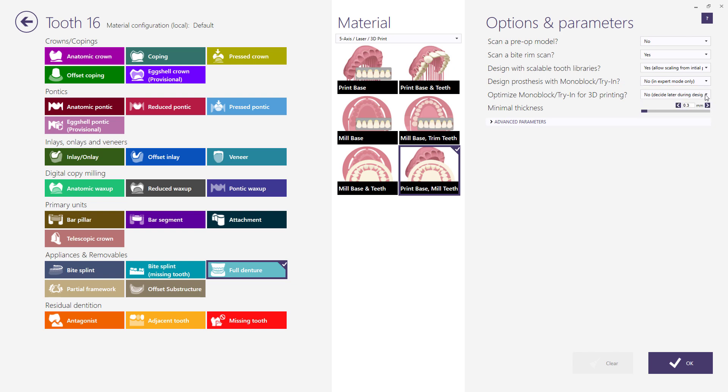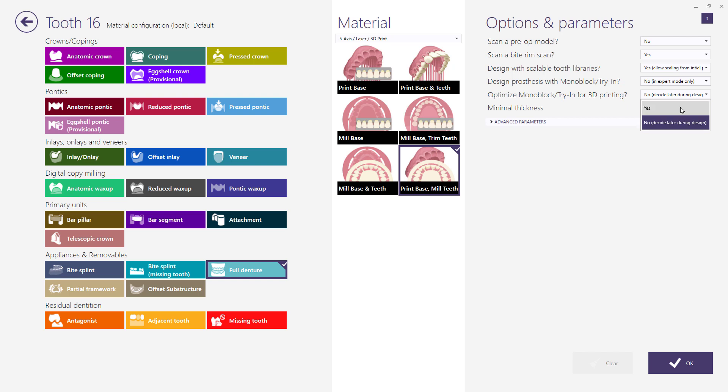You can optimize the monoblock for 3D printing. The optimization for 3D print is always set to no or decide later during the design. This is because of the lengthy process of optimization. However, it can be activated at any time during the design.